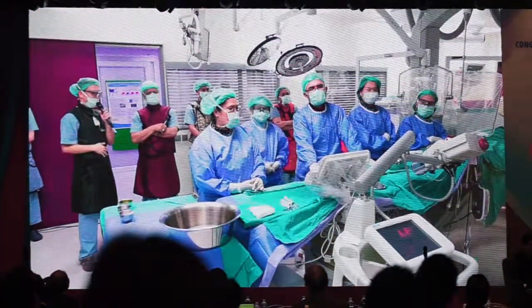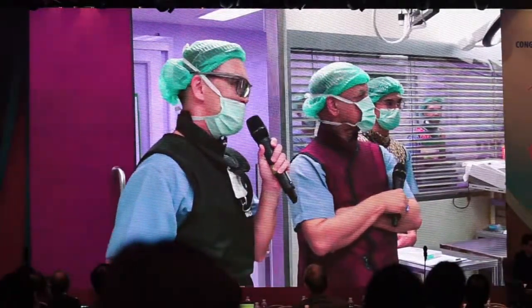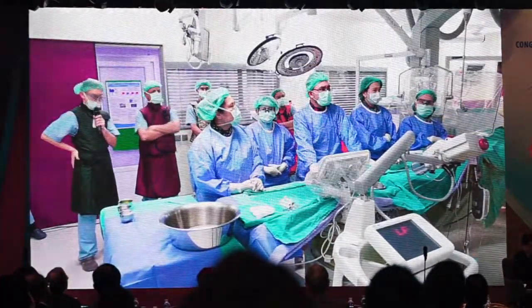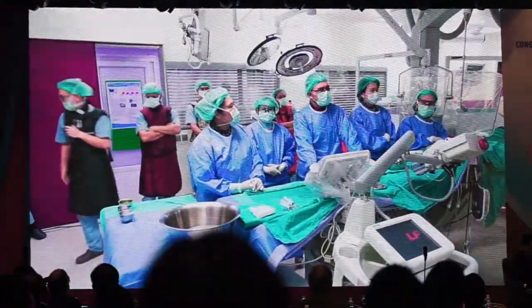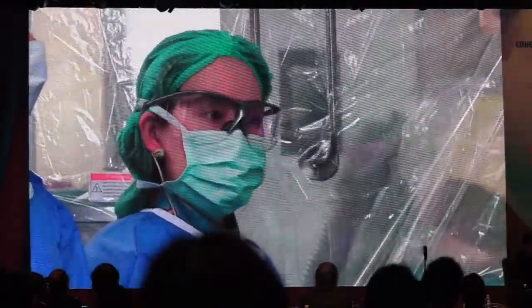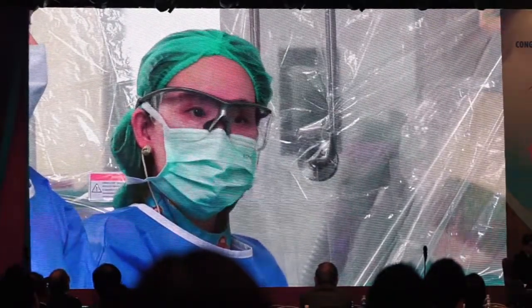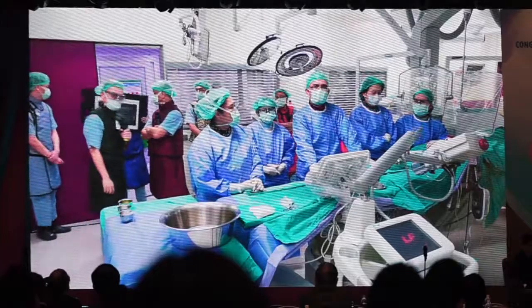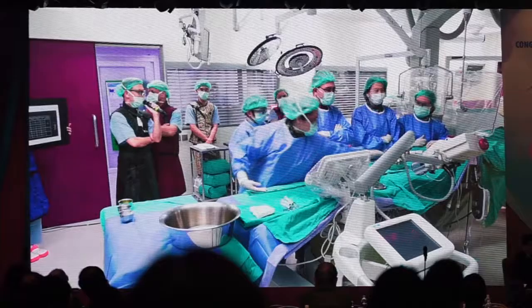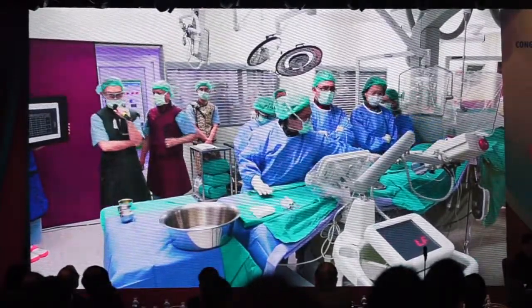I think usually the issue about inlet extension is the high degree of AV block that we see in Down syndrome patients. But to me, this is probably something that we could attempt. Just like what was said, maybe put the device in and see how it sits, and then also look at the rhythm. So the majority feels that yes, we should put in a device there and see how it works. But the concern is the positioning of the device. That is the main concern here.